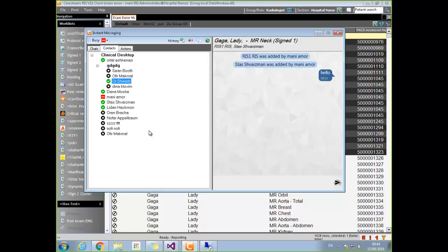I'm sorry, going back, because if you have a certain profile in the AD, you will almost guarantee you're using RIS. So there is a one-to-one. Also, I don't know if it's possible to create users based on AD within the RIS? In the Nordics, it's more and more common that the AD will control everything based on users, because that's where users are. They'll delete it, they'll maintain. In RIS, not so much.